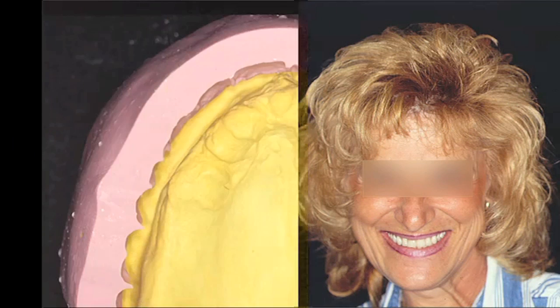So when our patient presented to me, as demonstrated on the left-hand side of the slide, significantly unhappy with the way her denture was, she showed me pictures and demonstrated to me how she routinely looks and wants to look. So we were able to find where her vertical dimension was from slide 1 to slide 2. Work on aesthetics, tooth size, shape, and color from her pictures and from her diagnostic information, and then give her a smile back that she deserved and she wanted. So let me show you.